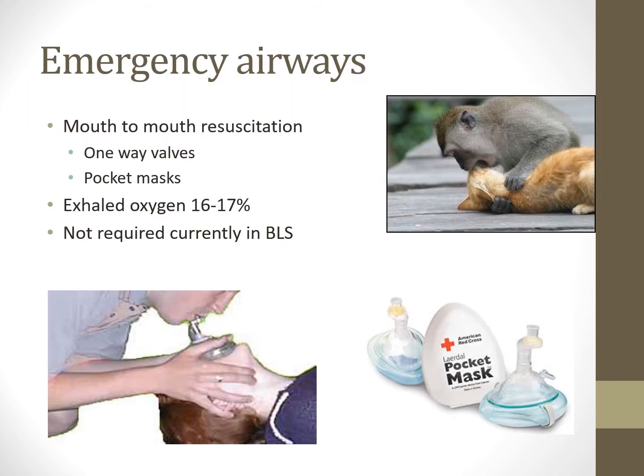All right, mouth-to-mouth resuscitation. This is just more for completeness. There are one-way valves and pocket masks. Just remember, here's the big thing with this: the exhaled oxygen that you're giving the victim, if you are doing some form of mouth-to-mouth, is hypoxic. It's lower than room air because it's used oxygen. So your average exhaled oxygen level is about 16 to 17%. That's it. So you're actually giving them hypoxic gas therapy, right?